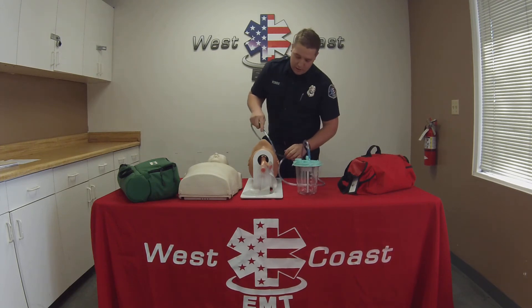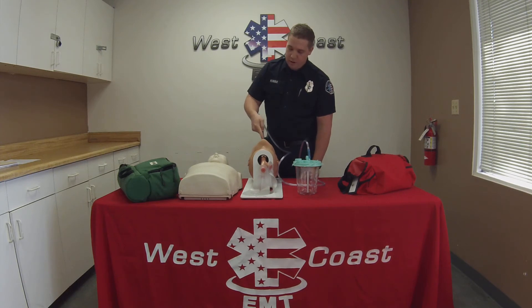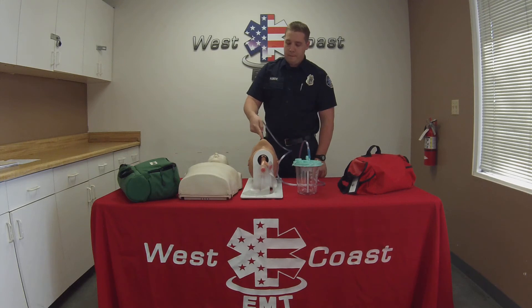We go ahead and hook up my suction using a hard tip suction catheter. I'm going to measure the suction catheter before I insert it, measuring from the earlobe to the corner of the mouth. I'm going to go ahead and insert it, not suctioning. Once it's in, I'm going to go ahead and start suctioning no more than 15 seconds or until the airway is clear. The mouth and oral pharynx are clear.